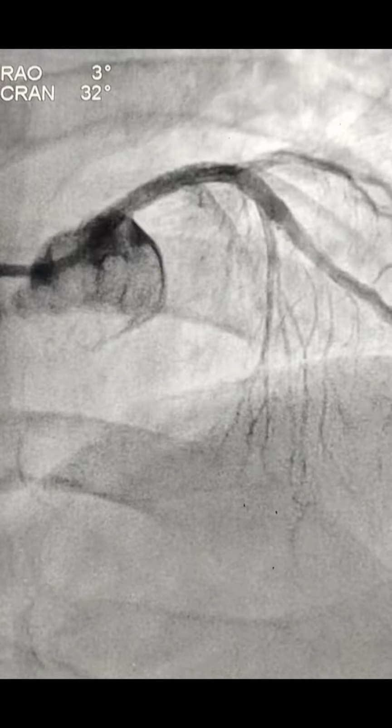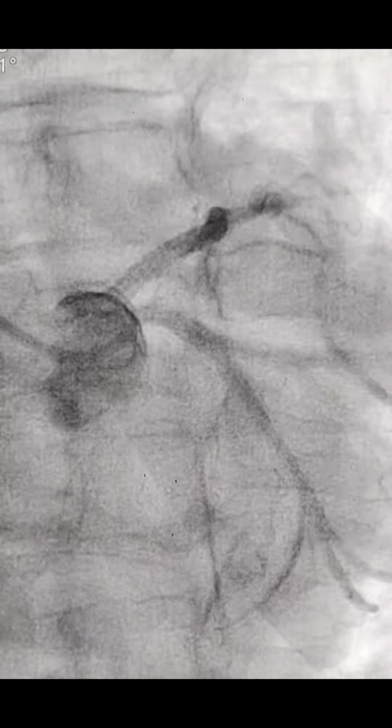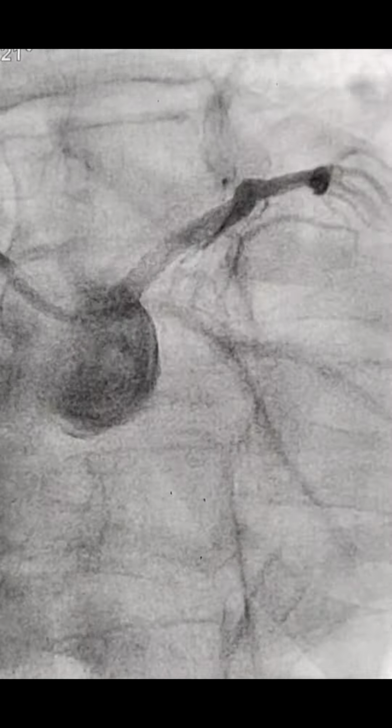You can see how wonderfully that ostioproximal LAD has opened. There's a caudal view and the catheter in the aorta to see the LCX also. You can see the ostioproximal LAD. The area we achieved is 9.5 mm square. This is after NC, you can see.